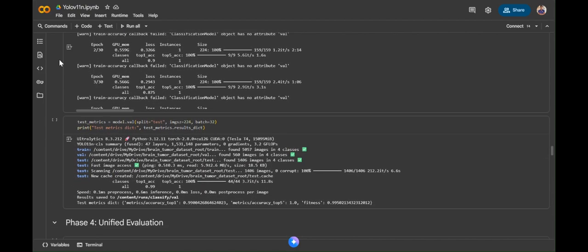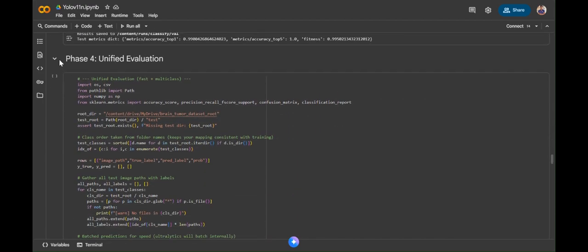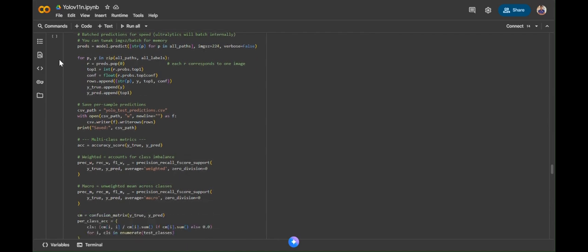We also plotted image intensity histograms to examine brightness and contrast variations across the dataset. These visualizations helped us design a pre-processing pipeline that normalized image intensities and enhanced feature detection.